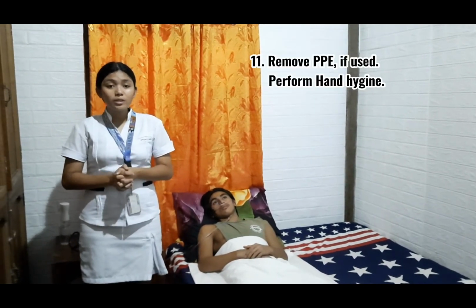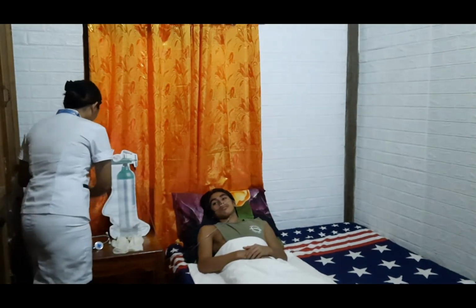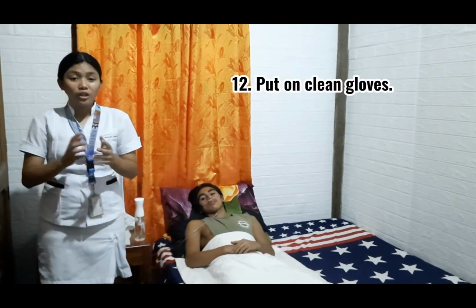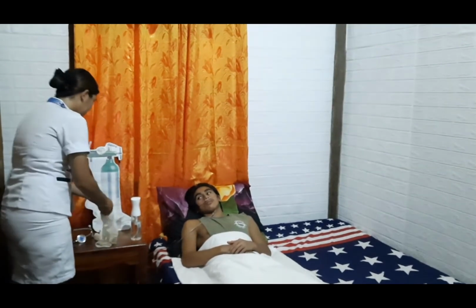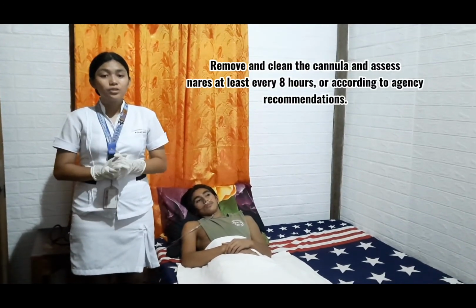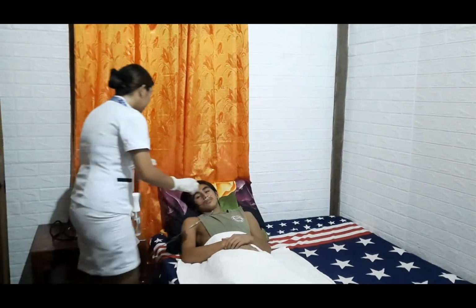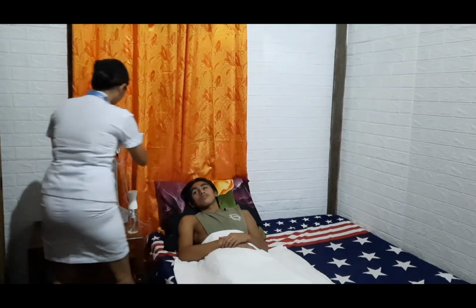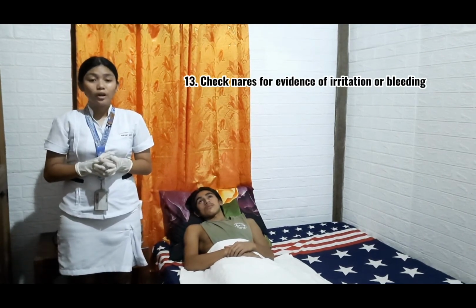Next, we need to remove PPE if used and perform hand hygiene. And next, we need to document. Next, we need to put on clean gloves. Remove and clean the cannula and assess nares at least every 8 hours or according to agency recommendation. And next, we need to check nares for evidence of irritation or bleeding.